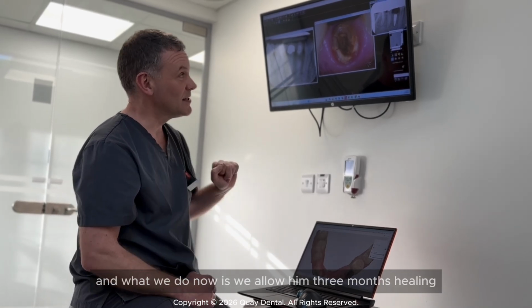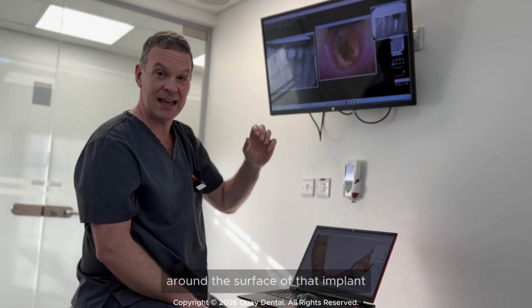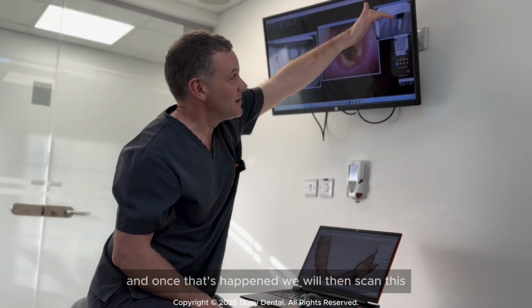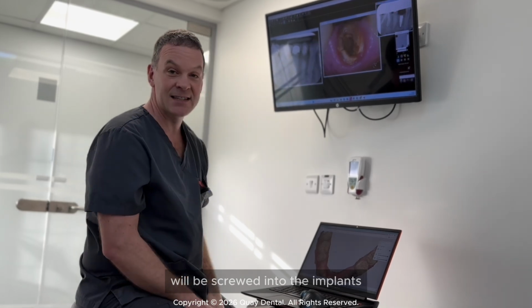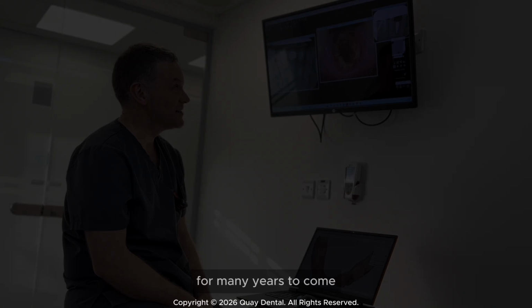And what we do now is we allow him 3 months healing. The bone will heal completely around the surface of that implant so that it forms a solid structure. And once that's happened, we will then scan this, take it to make his tooth that will go in there. It will be screwed into the implant, and that will function and feel just like a normal tooth for him for many years to come.